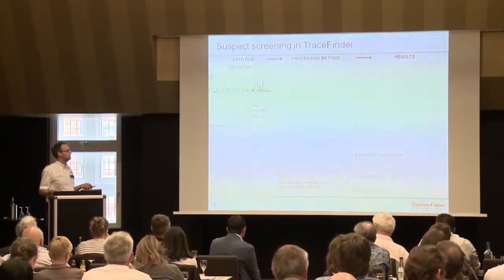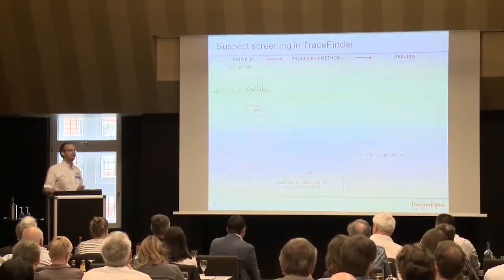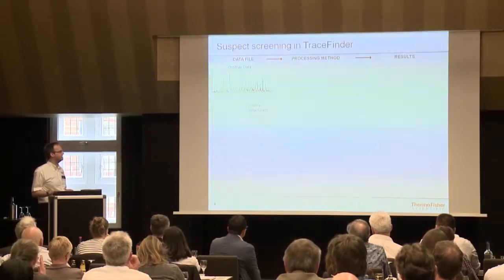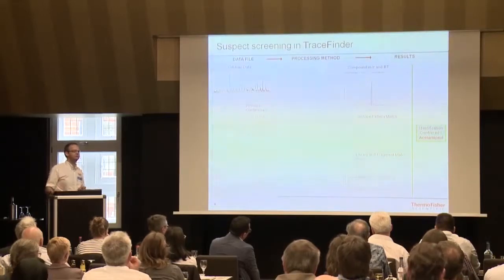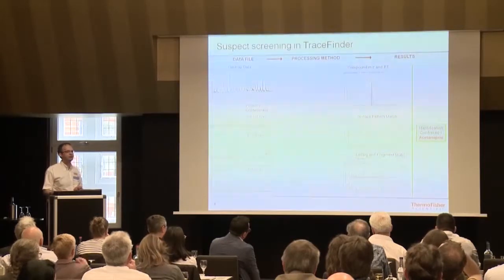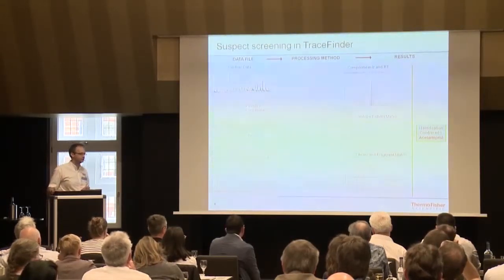So we can run a library search with the library spectra which are present, and we can run a fragment search. So out of this fragmentation data, we get the isotopic pattern match, we get the library and fragment match. So you have 3 points of confirmation besides the accurate mass and the retention time to tell us if we are pointing into the right direction or not.